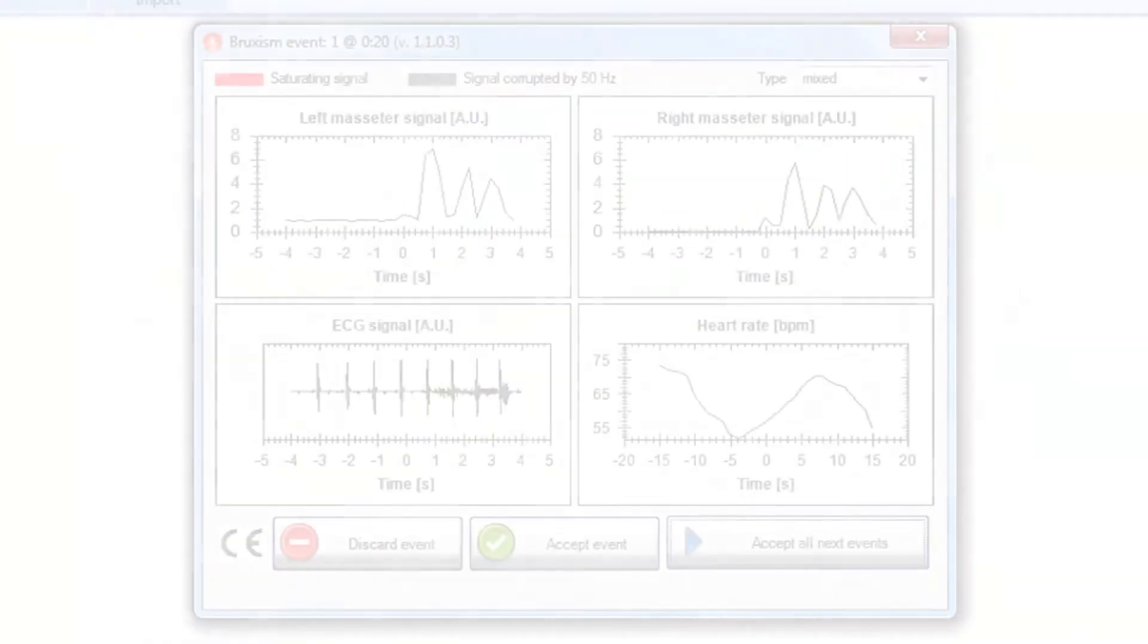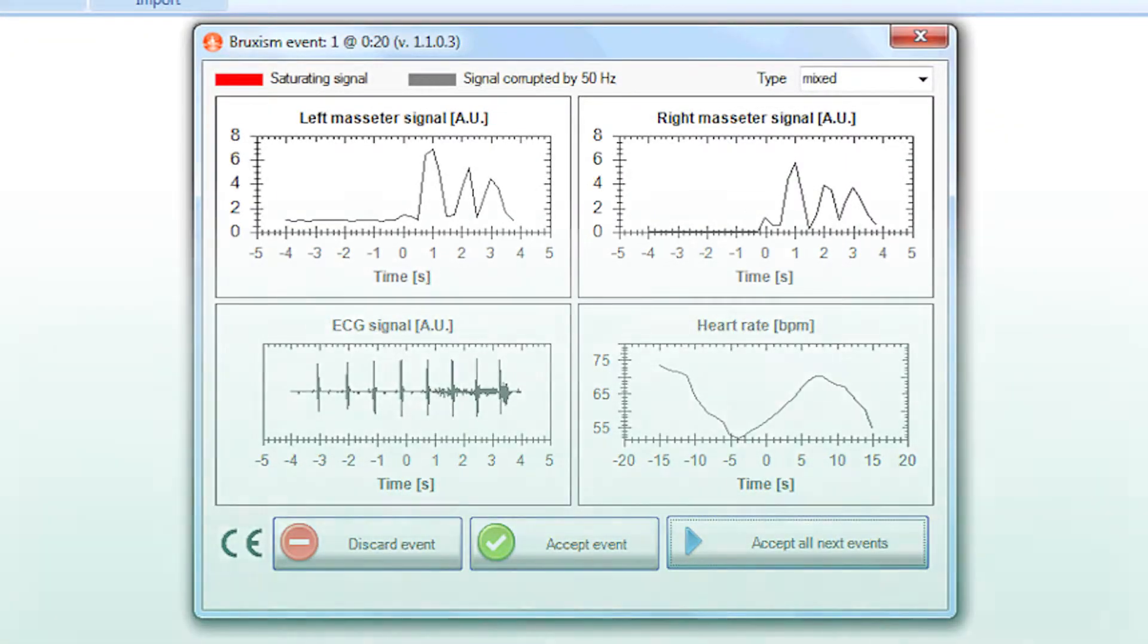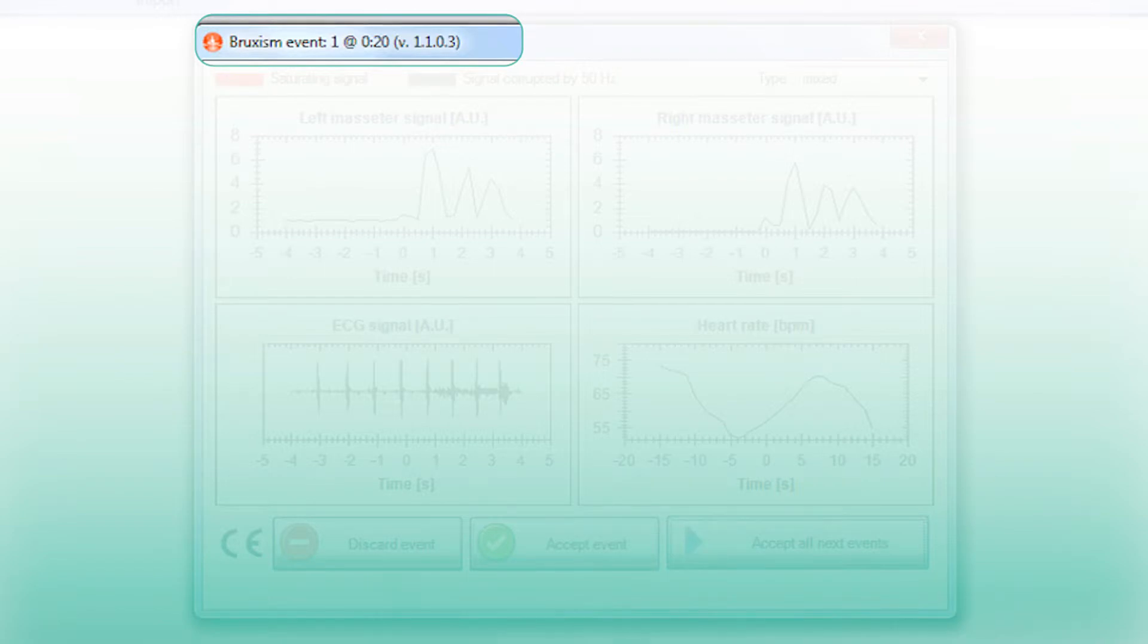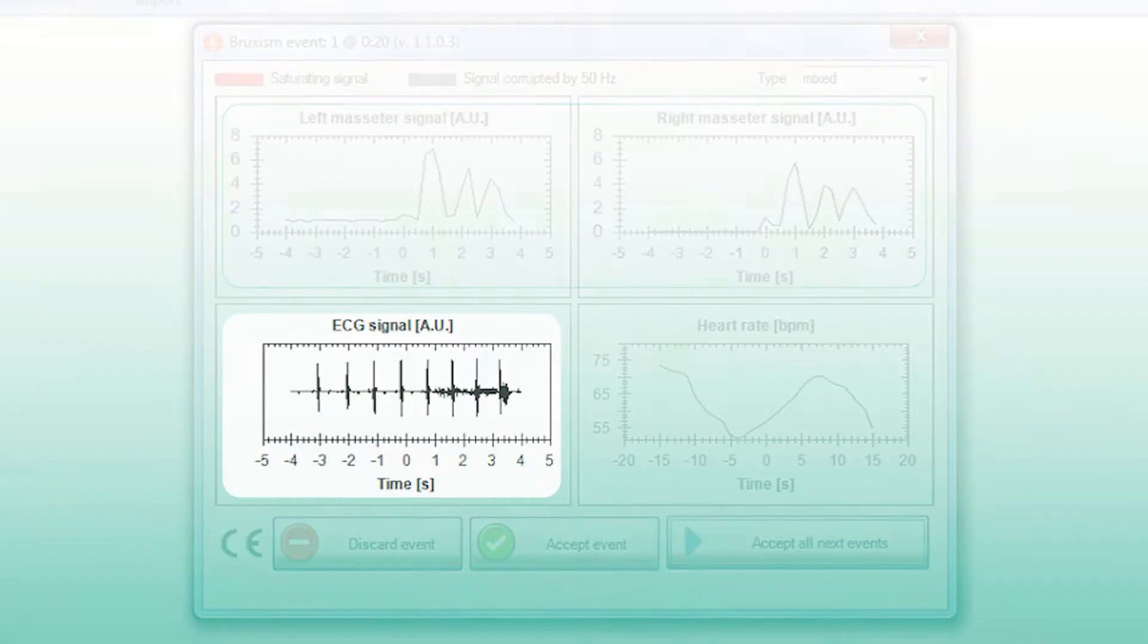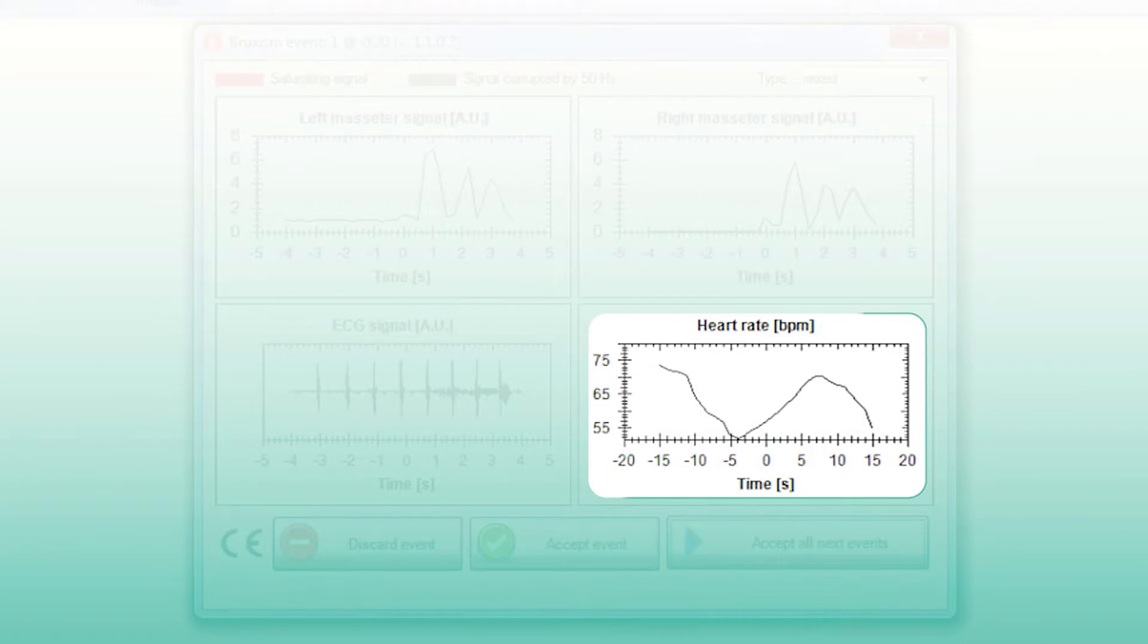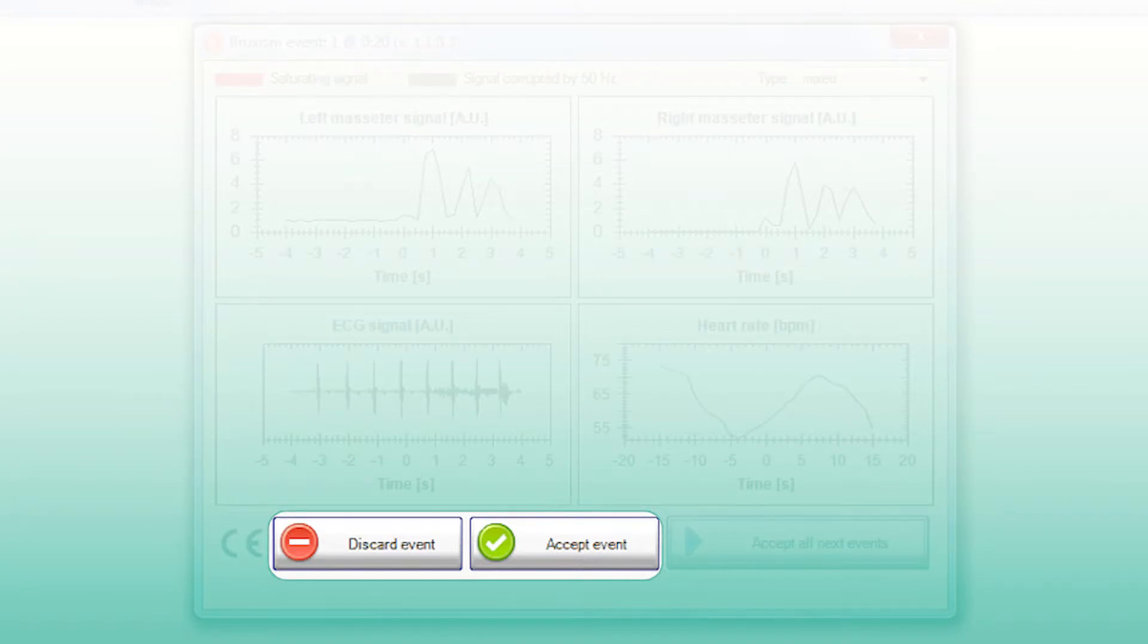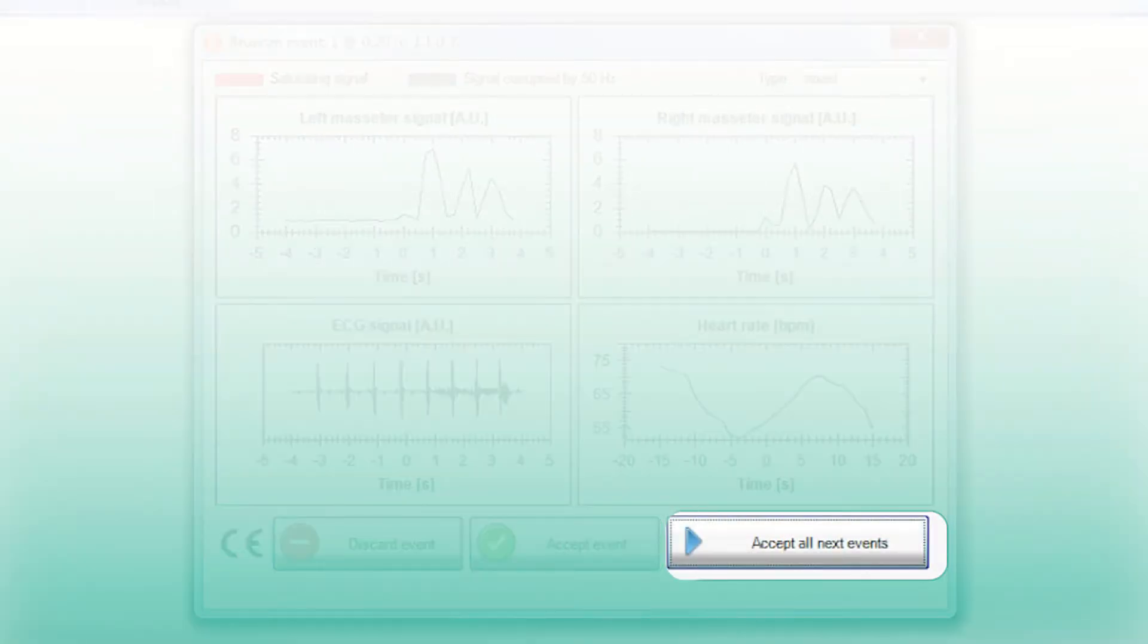For each event, it is possible to examine the instant when it took place, the activation profile of the masseter muscles, details of the raw electrocardiographic signal, the heart rate before and after the masseter activity. It is possible to accept or discard each event individually or accept all of the episodes.